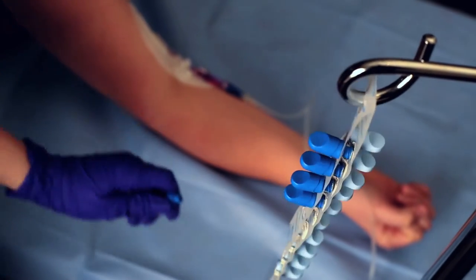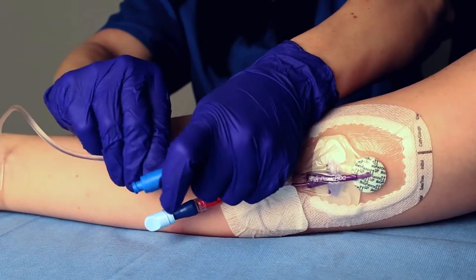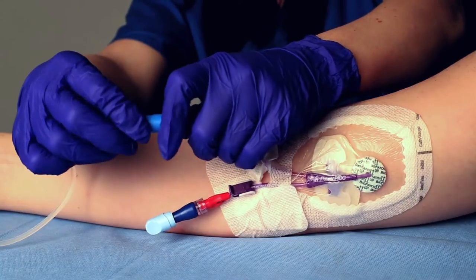Grasp the dark blue dual cap and remove from IV pole strip. Continue to hold the cap while disconnecting the IV administration set. Attach cap to male Luer by twisting until secured.